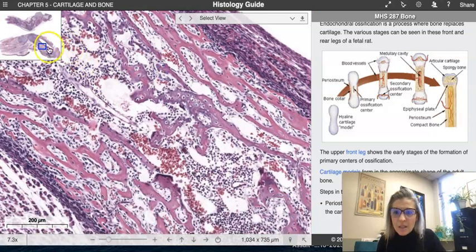We are really down here within the center of the diaphysis. And so, at the surface, look at how much more calcification to ossification is really happening. At the center, it's still one step behind.